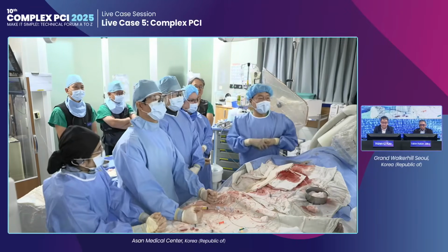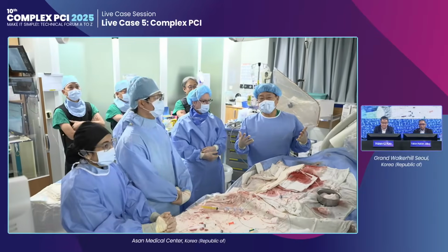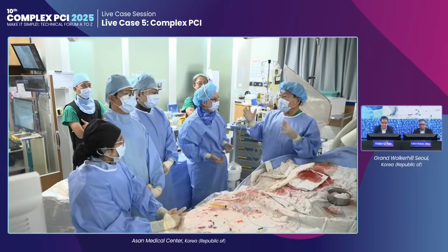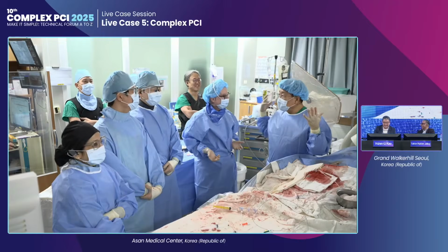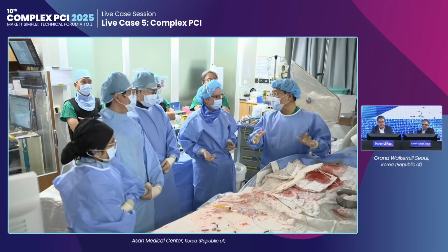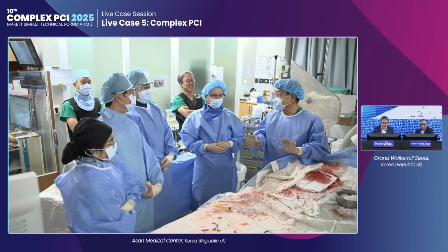Anyway, this is the last case, and most of our live demonstration cases today were left main, very complex ones. Why do people in Korea always get left main? The basic assumption of our course, our live demonstration, is that left main disease is not a surgical disease anymore, right?